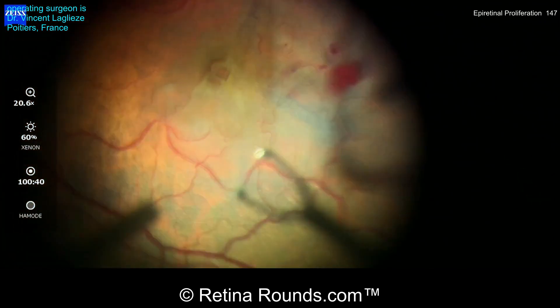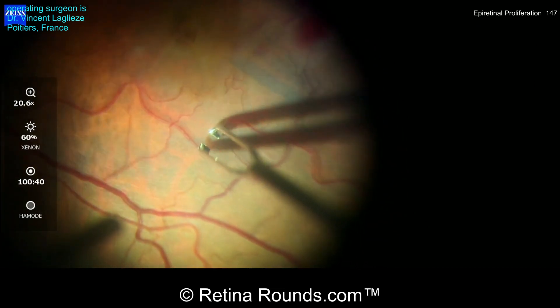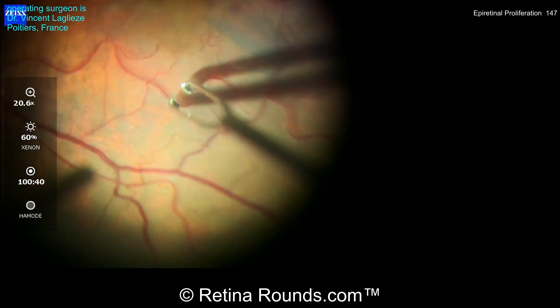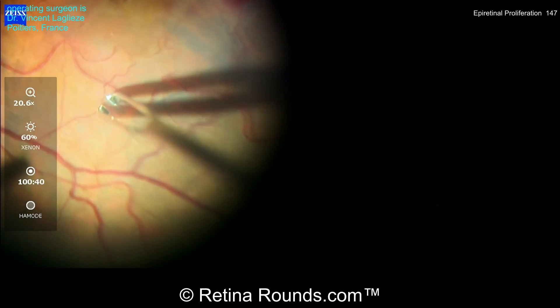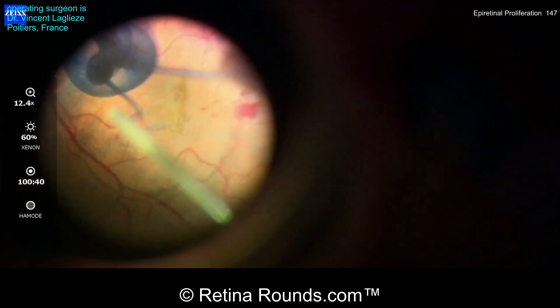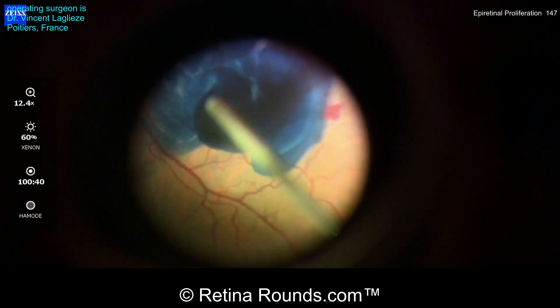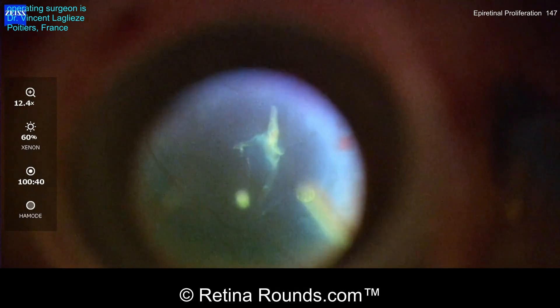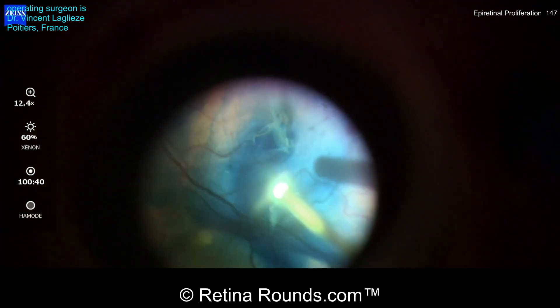Additional peeling of the underlying ILM is being extended beyond the edge of that epiretinal proliferation — getting as much ILM removed as possible to try to encourage closure of this macular hole. You can see some of that ILM that's been stained lightly with tissue blue. Now he's going to reflux a little bit more tissue blue, just to better visualize where any residual ILM elements are present.